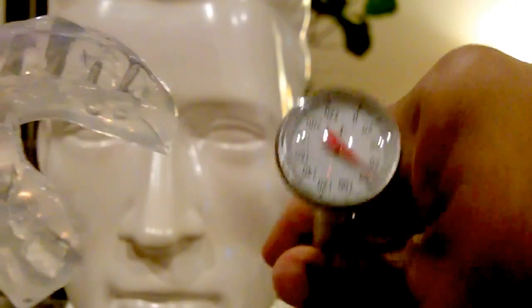They give you this mouthpiece, right? So as you can see, it has been molded to my upper jaw, for my upper teeth. So they give you this. You have to put this in hot water. Boil it in hot water. They even give you a thermometer for you to monitor the temperature. You take it out while it's still slightly warm. Make sure you don't burn yourself. You put this on and you bite right into it. I mean, you really bite into it until your teeth get right here to the bottom. And you have to keep this in your mouth for 5 minutes.